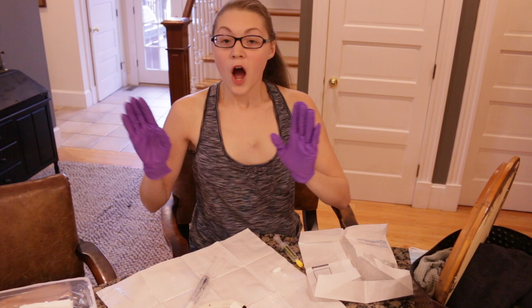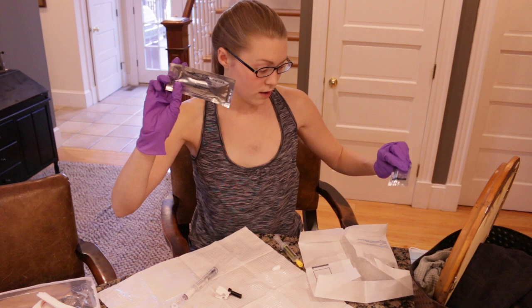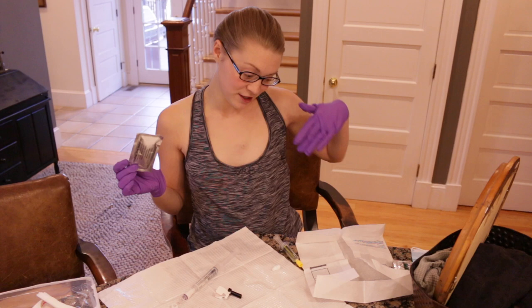So we've got our needle primed and ready, and we're going to do chloroprep to prepare my port for action. This one comes with a skin protectant — I'm not going to use that — and it also comes with the chloroprep swabs. Since I'm already sterile I can't move any of this stuff, but if I wasn't doing this video I would have Peter clear all this stuff away so it's not in the way. But hey, if you're doing this by yourself, you've got to make it work.